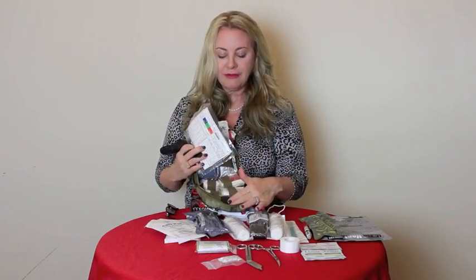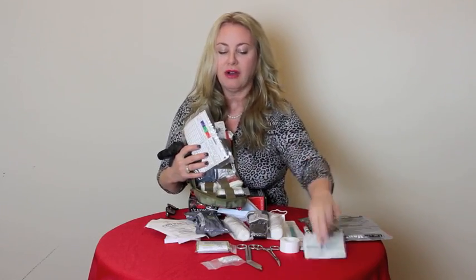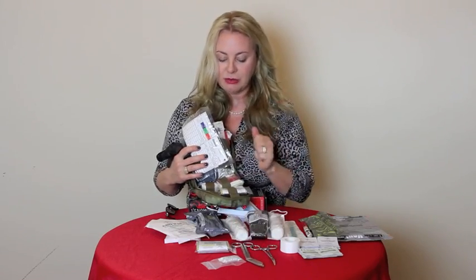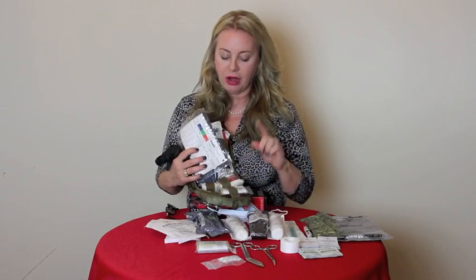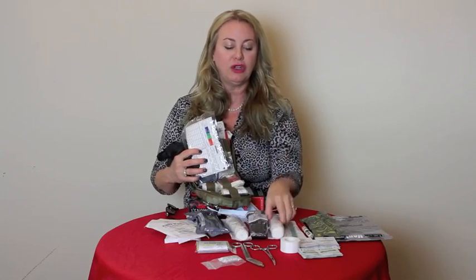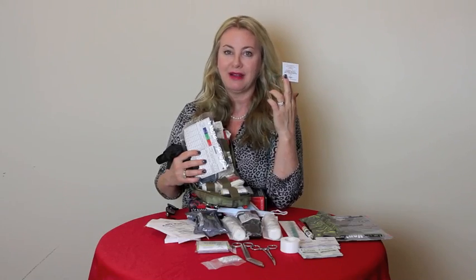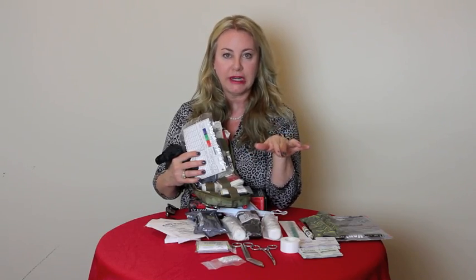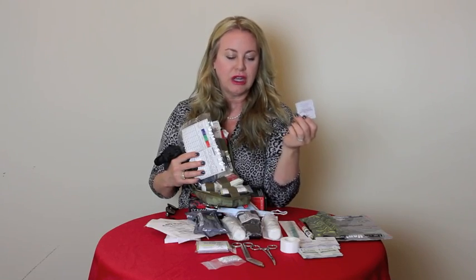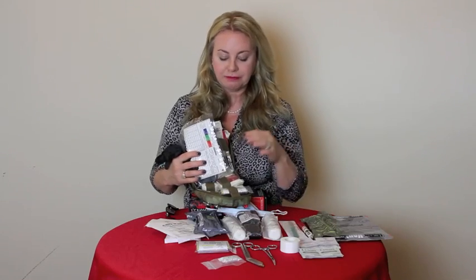So you have your gloves. Underneath your gloves are alcohol and betadine wipes. Now, the alcohol you can use to clean up your scissors. You can use to clean your hemostats before you use them. So you have both alcohol and betadine. The betadine is great if you're finished when the bleeding has stopped and you really want to put a dressing on it. You can use the betadine. Drop one of these in 8 ounces of water, potable water, anything you can drink. Shake it up, mix it up. Makes a great cleaning solution. You don't have to use betadine in the potable water, but it's not a bad idea.